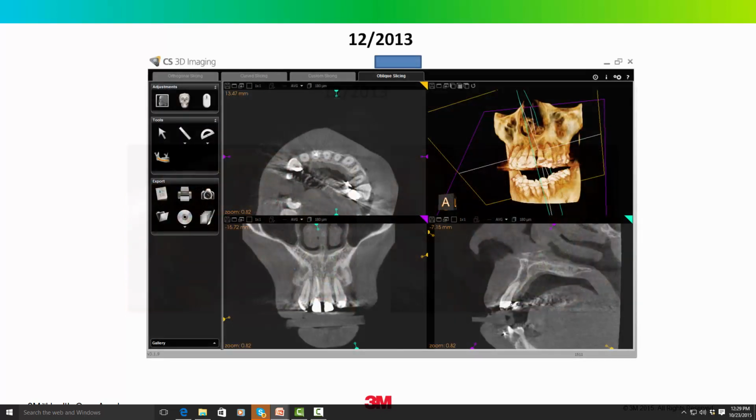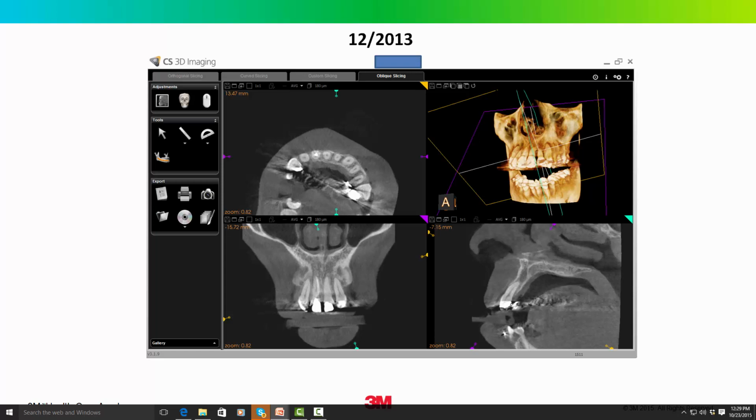However, he decided he didn't want to do that. He was kind of happy with the way his teeth looked, so he said, "I don't want to have the teeth removed." I took a progress cone beam, and the incisors were actually pretty well positioned within the alveolar housing. So I told him, "Okay, it's not ideal, but we'll do it. You're the boss."